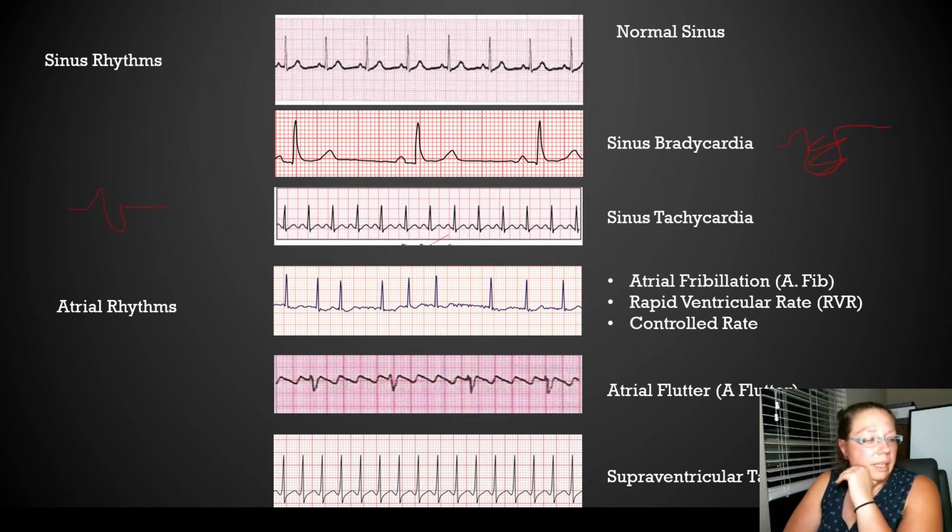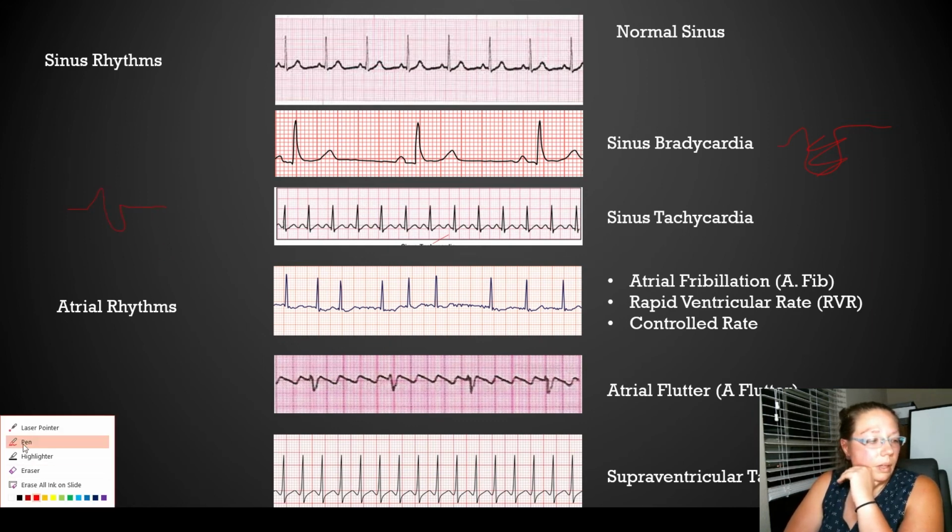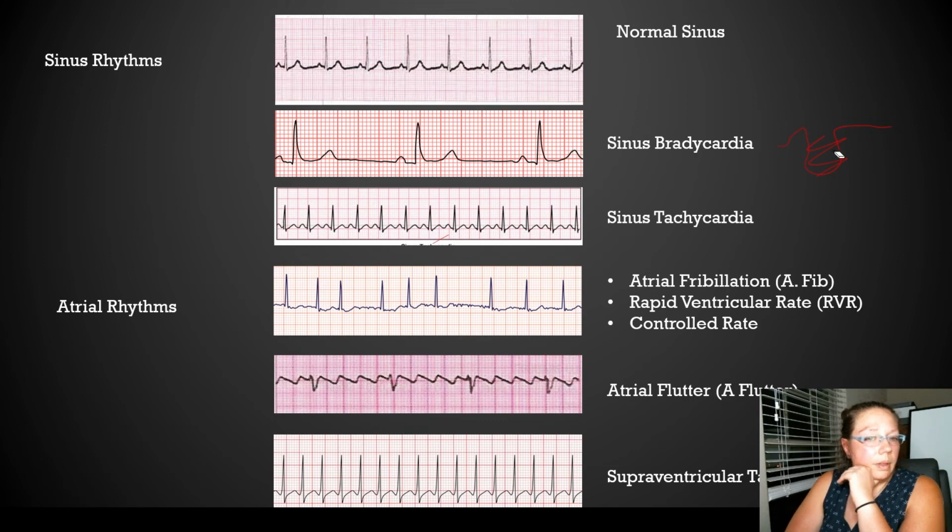It's going to look something like that. And that's a premature ventricular contraction. Okay, let's move on to ventricular rhythms. These are the fun ones.